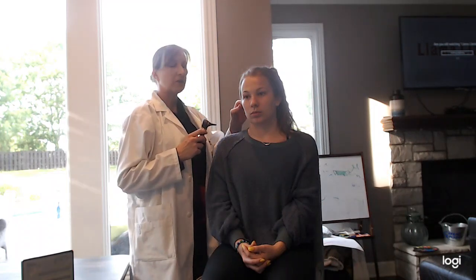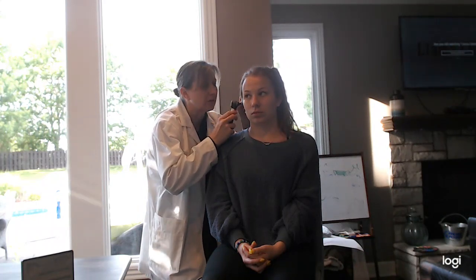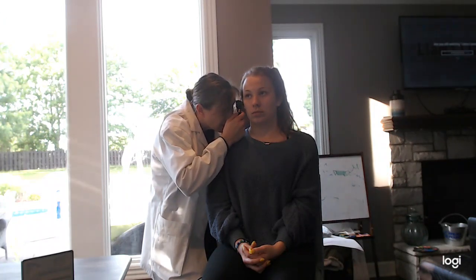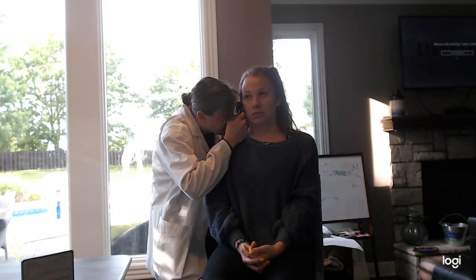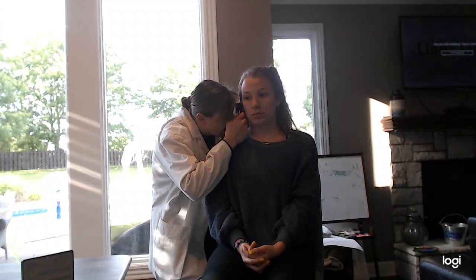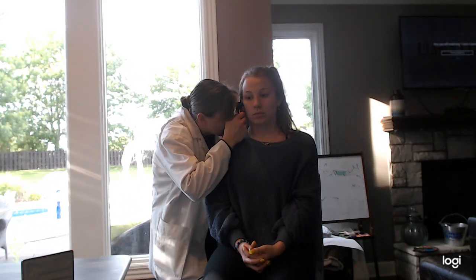We're going to do the internal ear exam. For adults, we're going to pull up and back on the tragus. For children, you would pull back and down. And you want to be very gentle when you're going in, making sure that there's no discomfort to the patient, getting into their inner ear. You're looking for any excessive cerumen. You're looking for the tympanic membrane. It should be a good pearly gray color. You want to see the light reflex there, and the malleus, and the umbo.